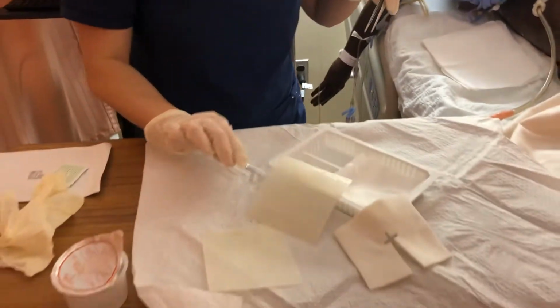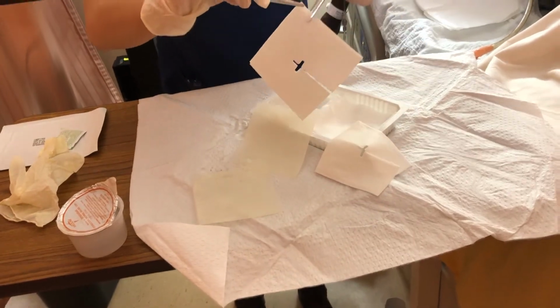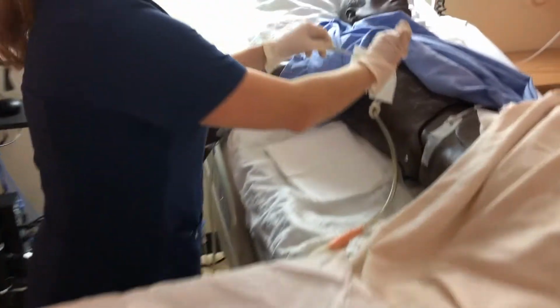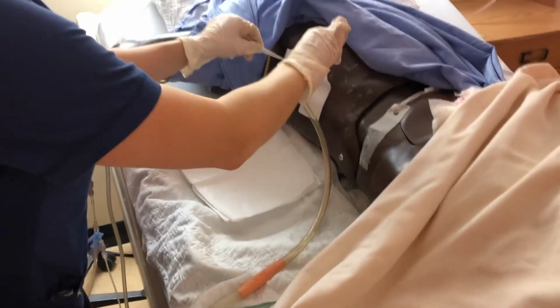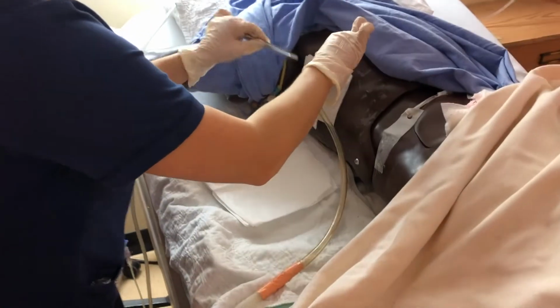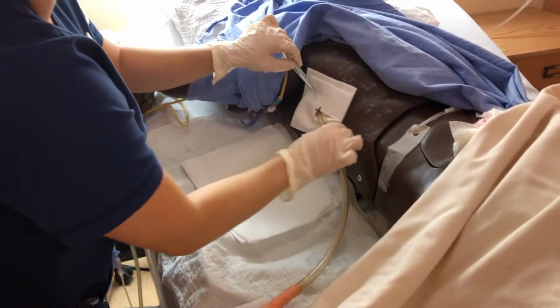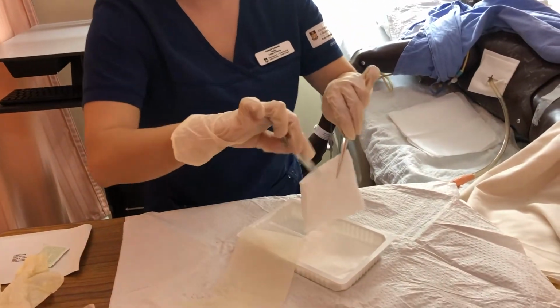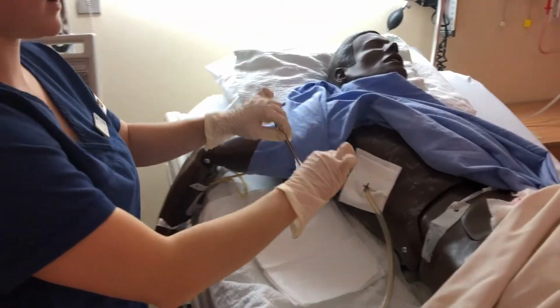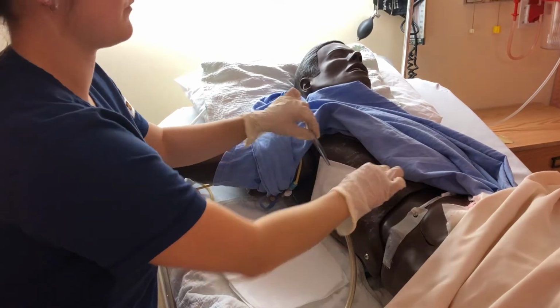So now I'm going to place my drain sponges. Make sure one goes one way, like that, and the other one goes a different way. Okay, and now I'll take one 4x4 and put it over top of everything. For the sake of the video, I'm just going to do it inside the glove, just clean and not contaminate it.